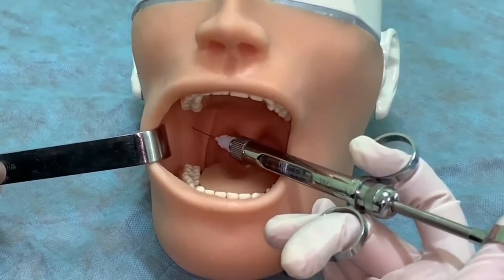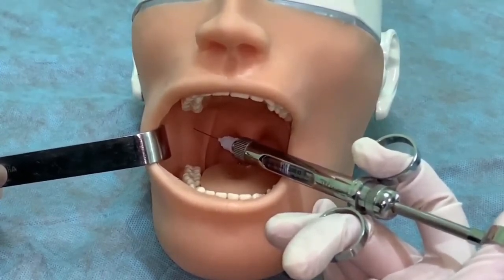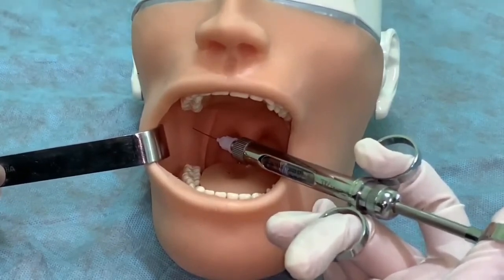Anesthetize the buccal and inferior alveolar nerves. Push the needle a few millimeters back from the soft tissue. Release another 0.5 ml of anesthetic to anesthetize the lingual nerve.